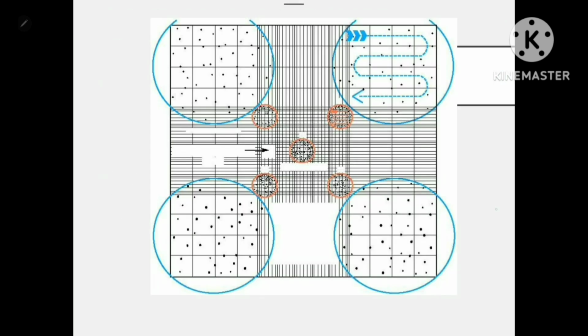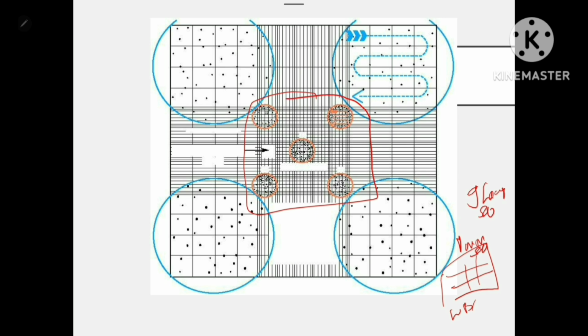It is made up of 9 large squares. Each square is around 1 mm square. This is subdivided for convenience in counting WBC. The center square is subdivided into 400 smallest squares.